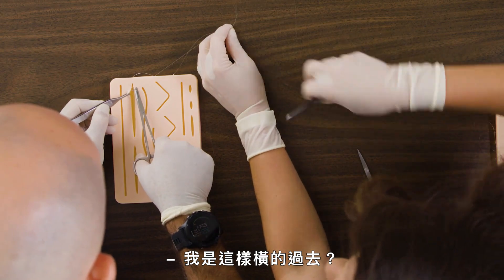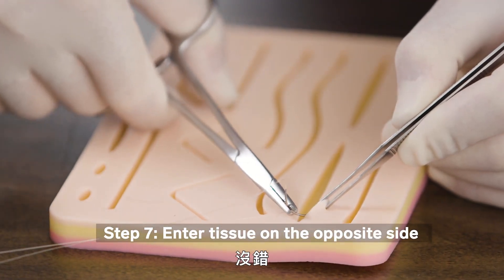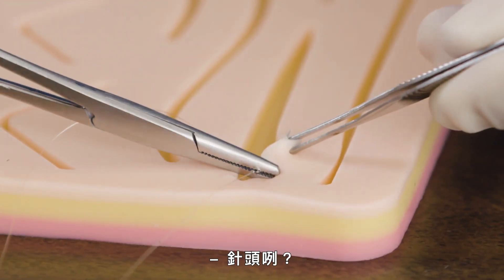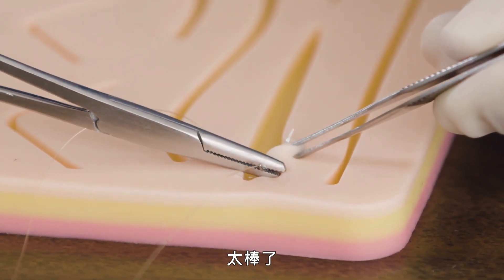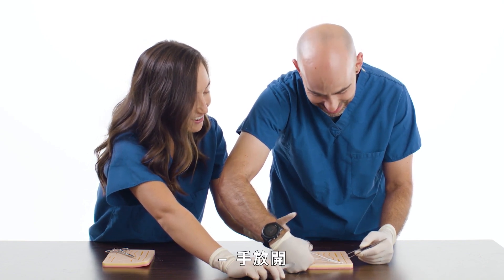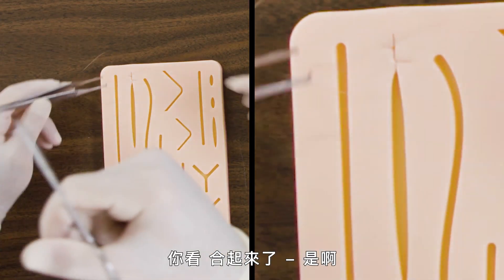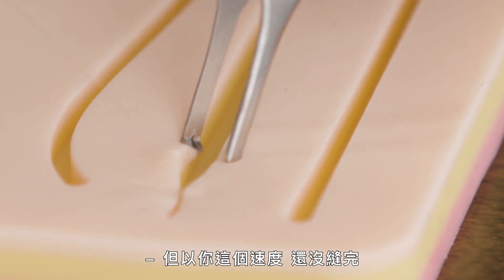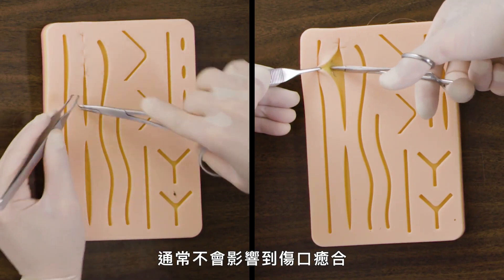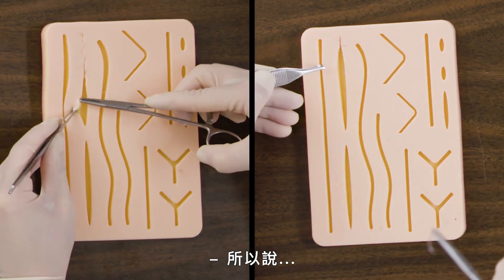Come across here — in this dimension. Push the tissue with this hand. There you go — that's perfect. Pull this out. Hey, it's closed! But at this rate it's going to heal before you even finish. Even if they don't look perfect, these tend to heal up. You can make this look like nothing ever happened — which is the goal. They're going to have a nice memento of their time.